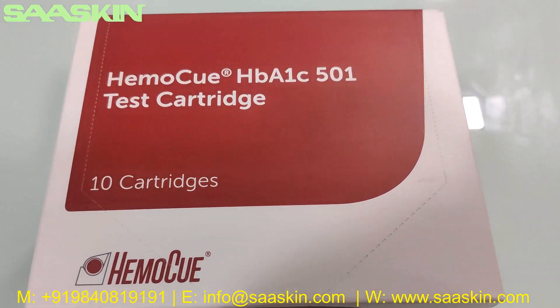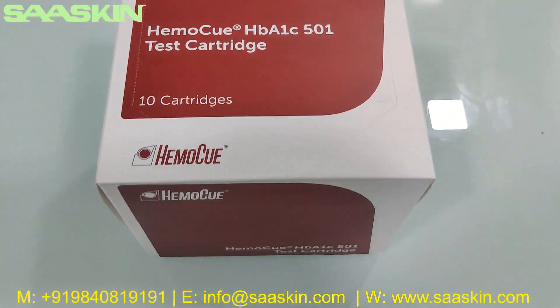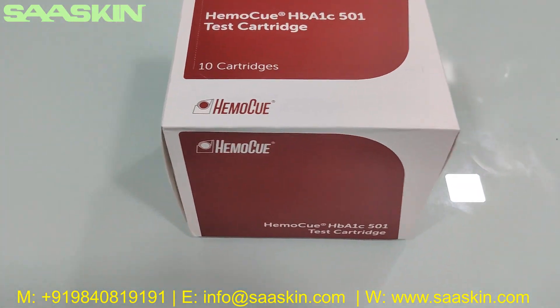Hello everybody, today we are going to see the unboxing of the EmoQ HbA1c 501 Test Cartridge Pack. It's a 10 cartridges pack.